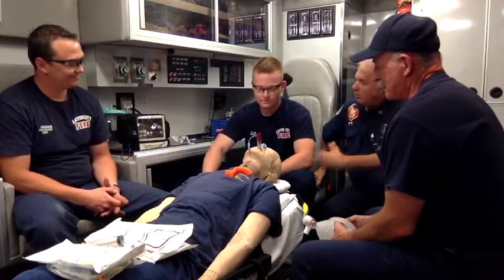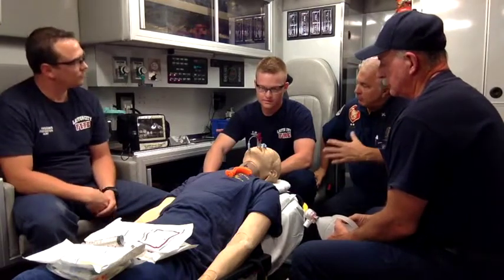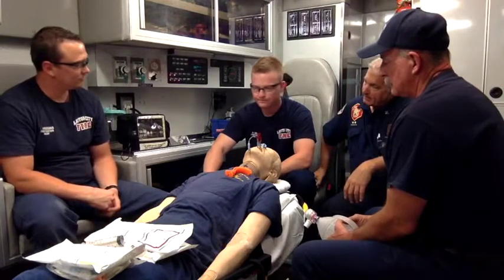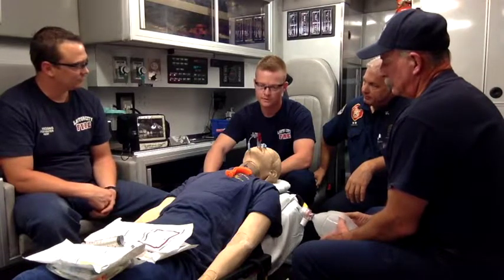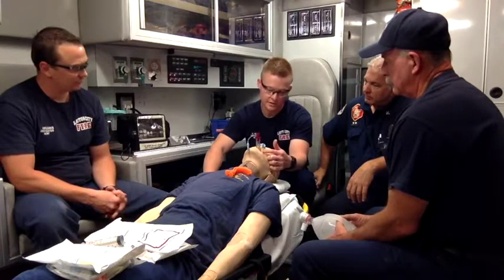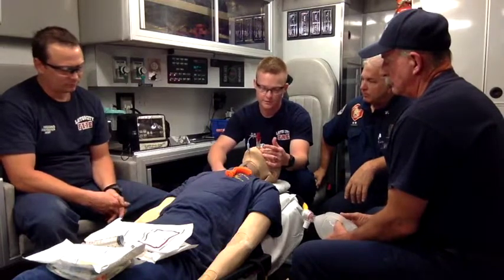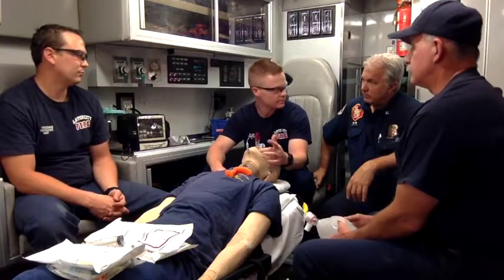So, what about you? What one thing did you want to really remember? Or if I asked you to teach everybody something, what one thing would you say? Know your equipment. Know where it's at. Know if you need anything extra. One thing we've missed is that the dummy's pre-lubed; it comes with water-based lubricant. Make sure that we're proficient in our skill set.